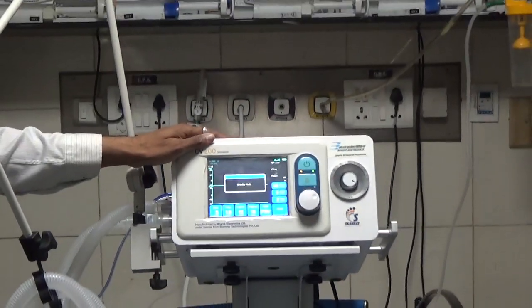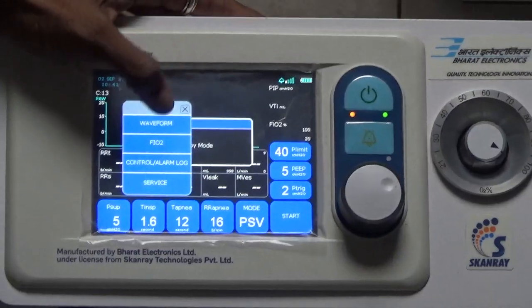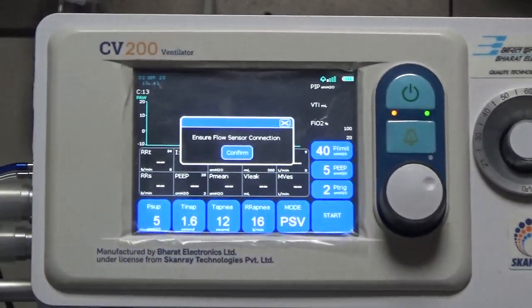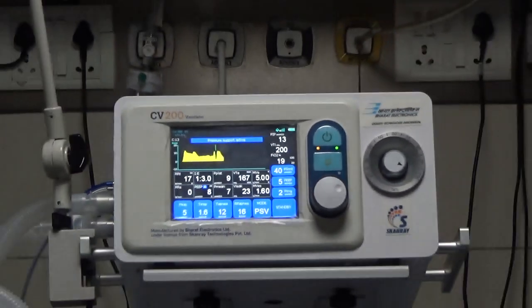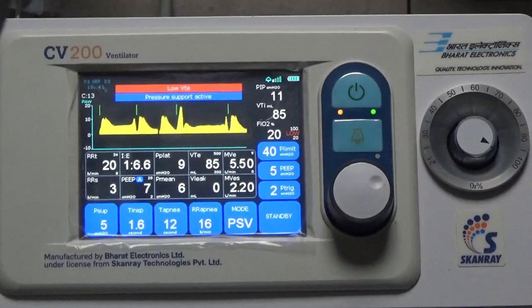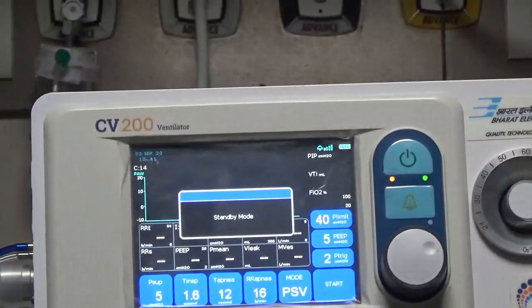Okay, so now I'm going to start the ventilation, and for starting the ventilation, I'm going to switch the waveforms to wave pressure and number. Yes, and now I am going to start the ventilator by pressing the start button, and I am going to confirm it. Okay, you can see on the test lung, I am now beginning to see the parameters. Please remember, with a pressure support of 5, I am going to generate less tidal volume only, so I am not very worried about that. Once I have made these settings, then the next thing I have to do is to tie the mask properly. If I don't put it on standby, it's going to give the alarm constantly.